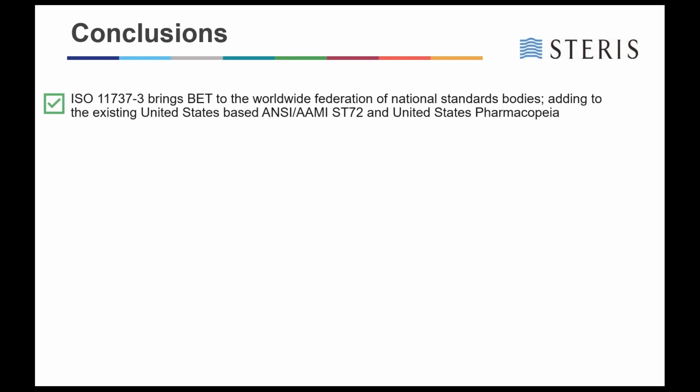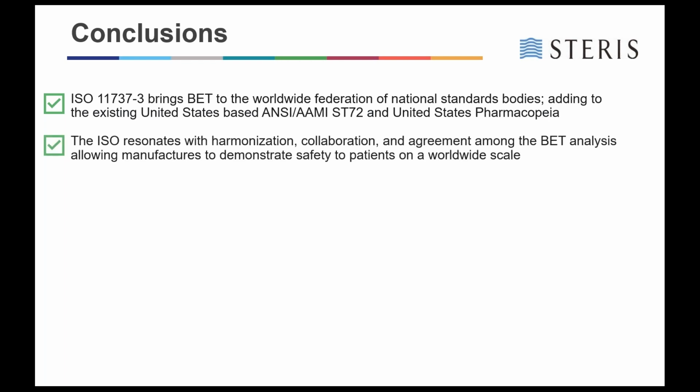So first of all, the ISO 11737-3 brings the BET testing worldwide through the Federation of National Standard Bodies, and it adds to the existing United States-based ANSI AAMI Standard 72 and the United States Pharmacopeia. Additionally, the ISO resonates with harmonization and collaboration and agreement among the BET analysis, and this helps the manufacturers to demonstrate safety to patients on a worldwide scale.